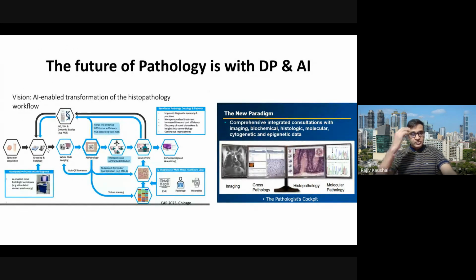So if you ask me, the future of pathology is that at each and every step, you will see some role of these IT or AI-based applications, right from specimen receiving to routine diagnostic assay testing, as well as molecular testing. And this will be your future pathology cockpit, where all the information you want is on your screen, right from the radiology information to IHC-based markers and the molecular profiling results, all coming and sitting in one place.